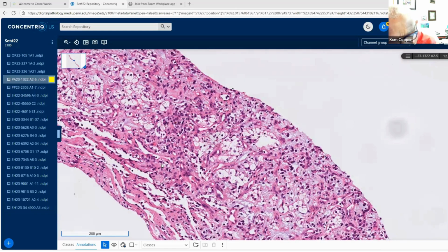But also don't confuse that with the myxoid pseudotumor that Dr. Falk described, which is perinephric, and I think that was in Modern Pathology. And in that context, you have to rule out dedifferentiated liposarcoma, but that entity should not be confused with dedifferentiated liposarcoma. And the only way to separate them is with MDM2, I'm afraid. So you'd have to resort to either antibody or FISH. Okay, so pseudotumor or myxoid and inflammatory, but here you go with renal cell carcinoma embedded in the tissue.